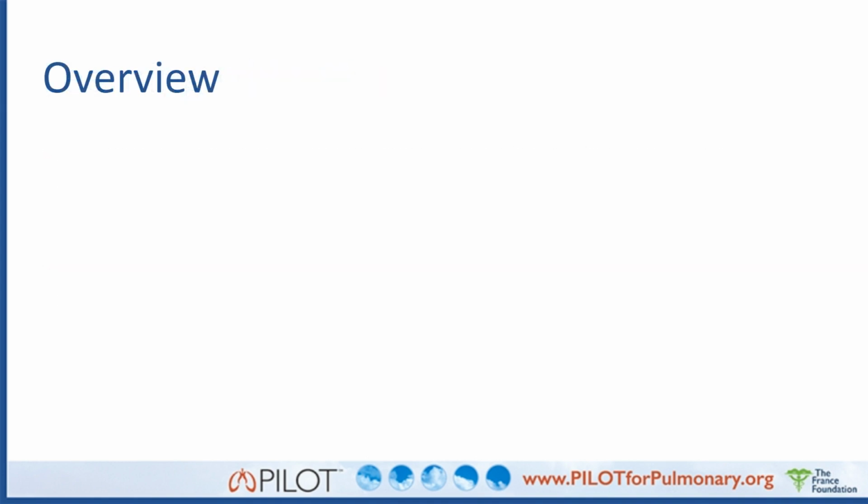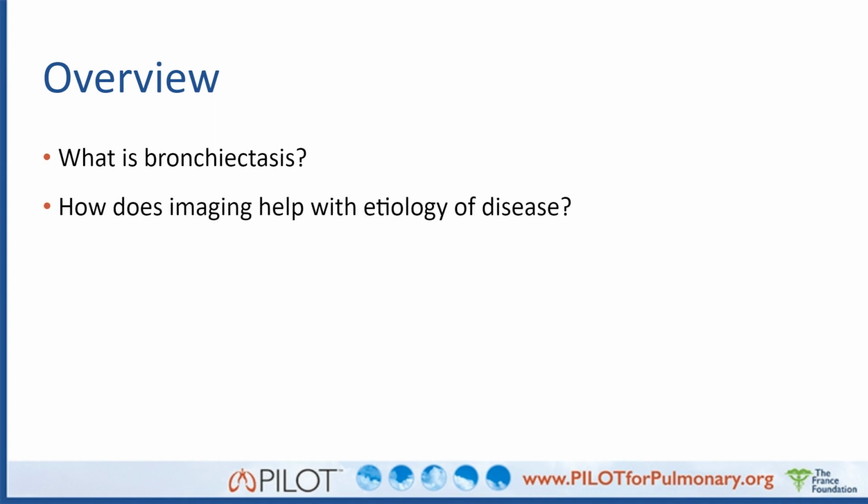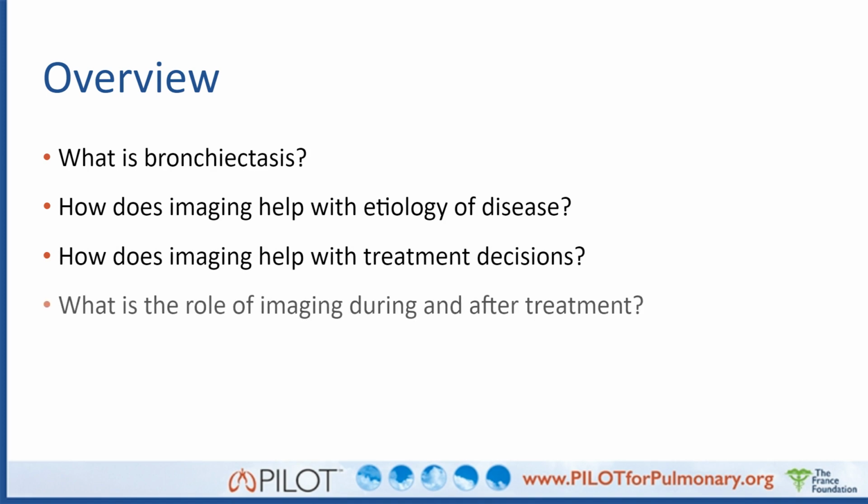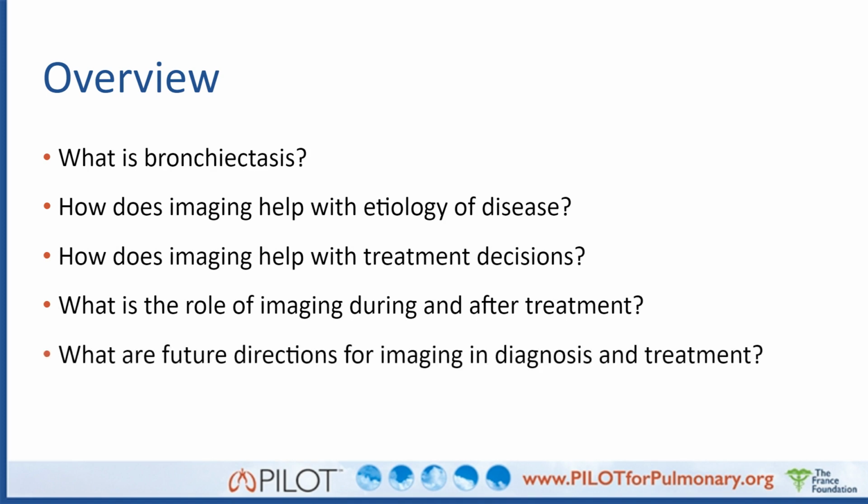In this program, we'll talk briefly about what we mean by bronchiectasis, and go over how imaging helps understand the etiology or potential etiology of their condition. How does imaging help with treatment decisions? What is the role of imaging during and after treatment? And then we'll close with a discussion of future directions for imaging in the diagnosis and treatment of bronchiectasis.